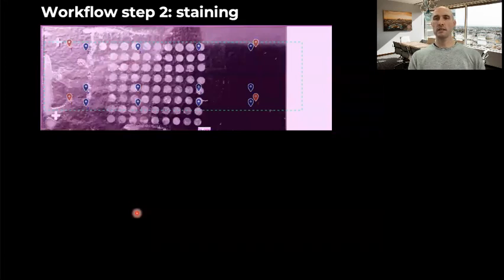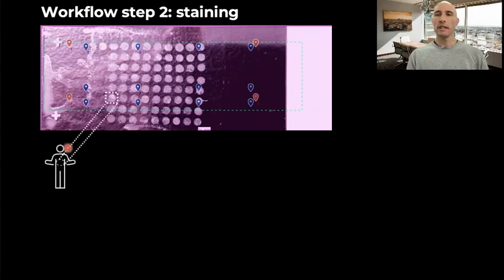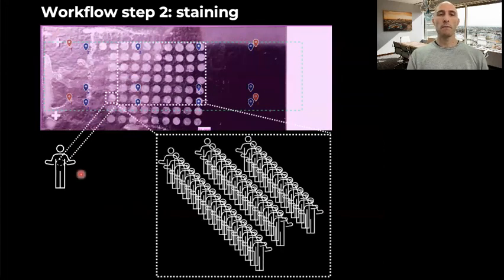Basically, staining does not differ from the typical protocols for immunohistochemistry. They are exactly the same. The tips and tricks I can give you here is, when possible, use what you have here, which is called TMA, tumor or tissue microarray. As you know, a tissue microarray has cylindrical cores, all of them normally from different paraffin donor blocks. So each of these cores is a patient, as you can see here. The benefit of using the TMA is that you can put many patients in only one slide, and then you will stain this slide glass with only one antibody cocktail.